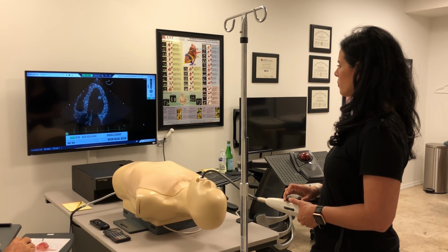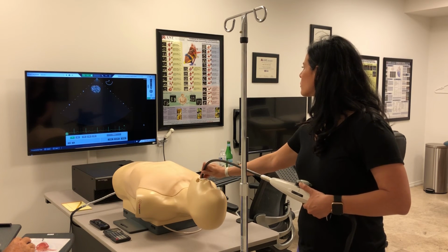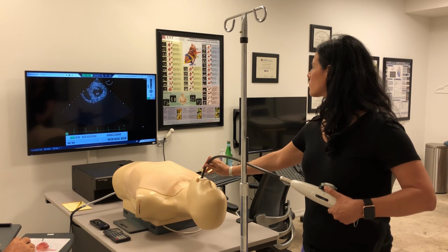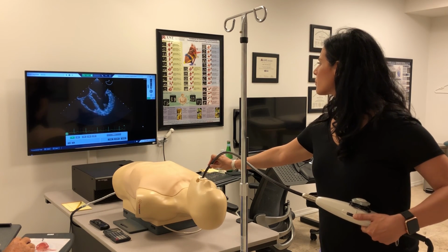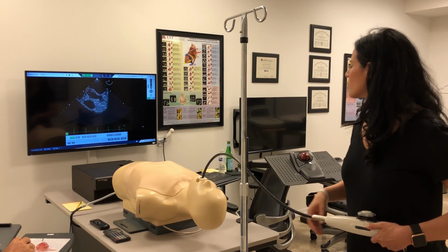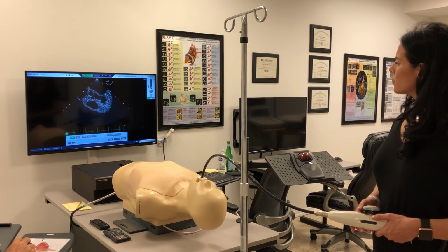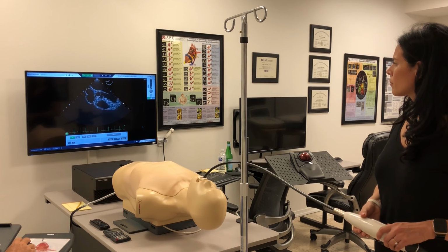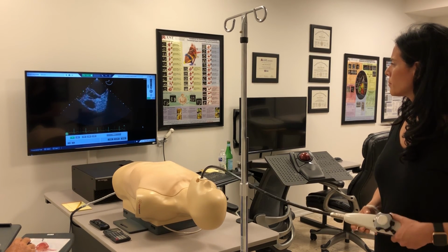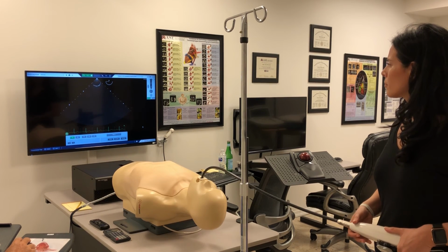So let's go ahead and come back to 0 degrees where you're at already and pull back into the thorax. And I've come all the way up to the 5-chamber view. Good, there's the junction. Here's the 5-chamber view. Now you have to decide where the descending thoracic aorta is. Well, it's in the left chest behind the left lung. So that means you have to do a hard rotation of the probe handle to drive the crystal to the image to the left chest behind the left lung.